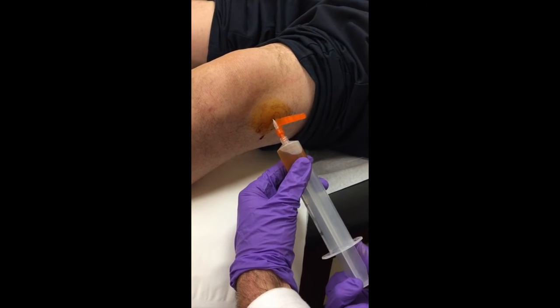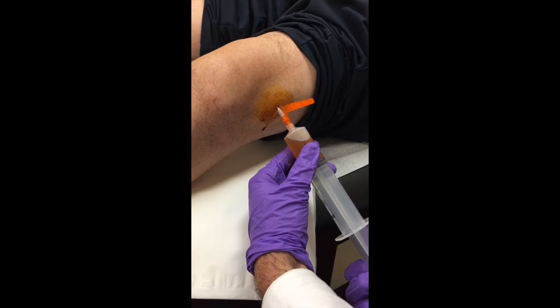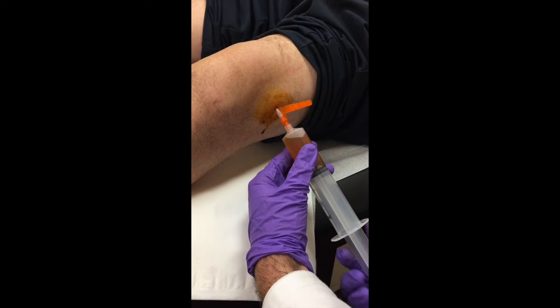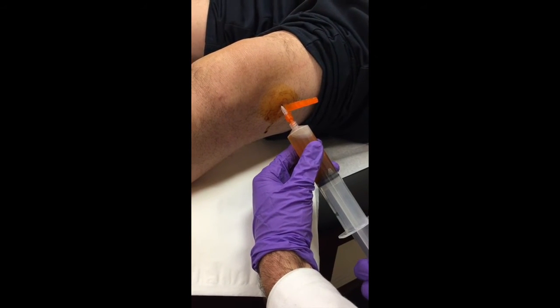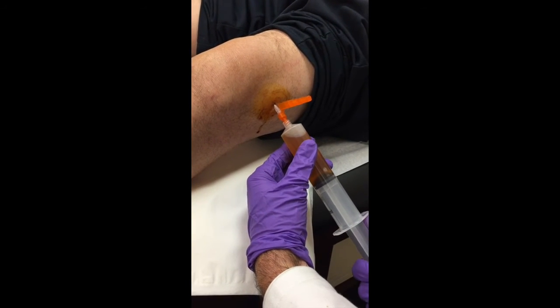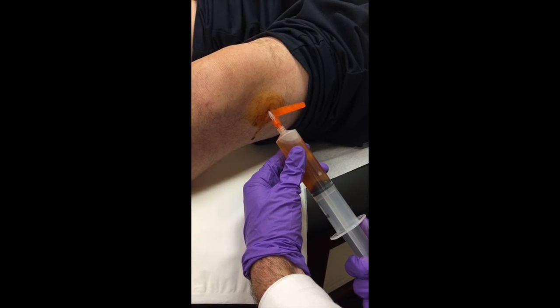You're stabilizing with one hand and pulling with the other so you're not trying to move the needle around. If you need to, you can slowly readjust as needed, but for the most part you're just slowly pulling. You can see his fluid is a little bit darker, a little blood-tinged, but nothing too crazy.